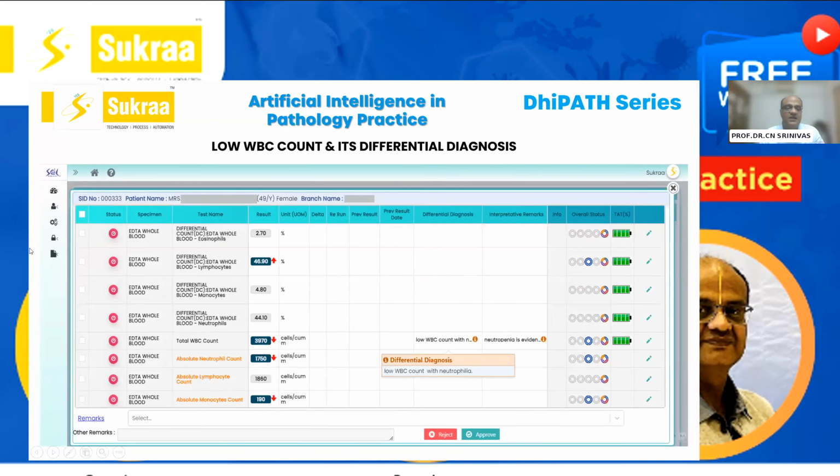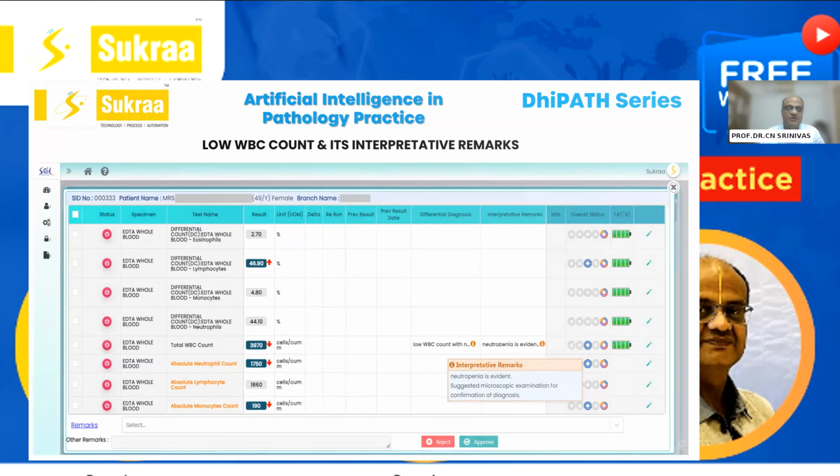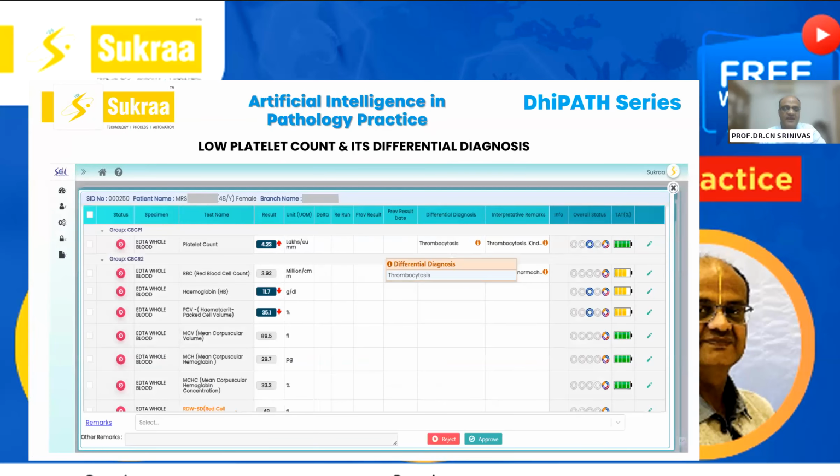You have certain indicators visually also. On the extreme right-hand side, you have the turnaround time, whether it is upheld, and you have the overall status, with circles indicating that this is neutral, or has some abnormality, high or low values. In one of the cases the differential count has high lymphocytes. You have WBC counts with neutrophilia, sorry, neutrophilia you have. And when you look into it, you also get neutropenia, which is evident in one of the cases, which suggested a microscopic examination itself. So friends, I think I'll stop because we have some questions.